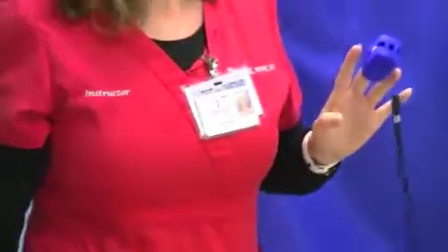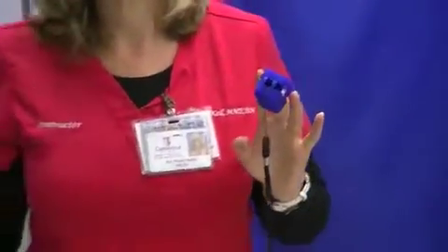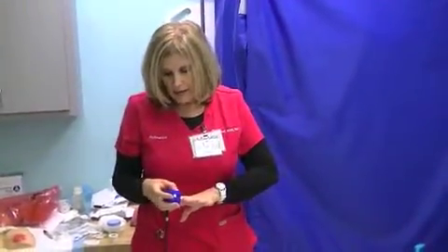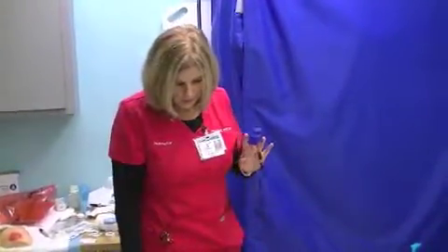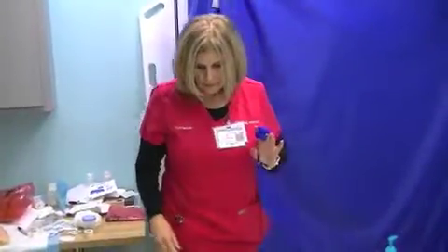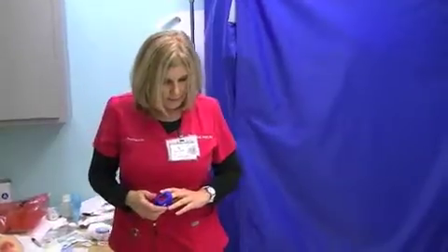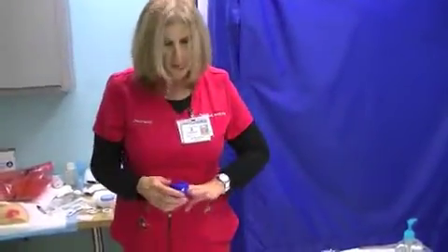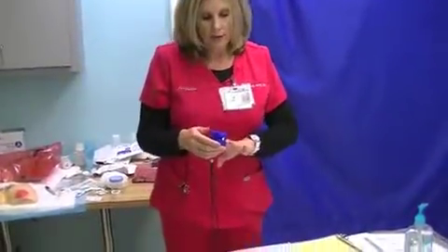And it usually takes anywhere from 60 seconds to 2 minutes. And so when they do the 60 seconds to 2 minutes, it will pick up a reading. Now we want to make sure that we read the measurement on the tray. The normal reading for mostly is 95 to 100%.